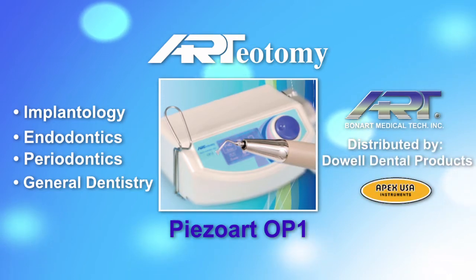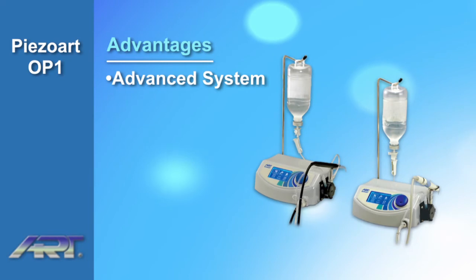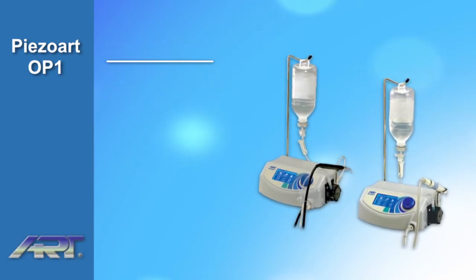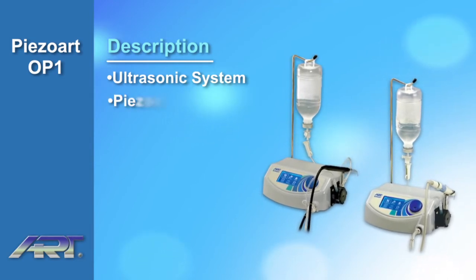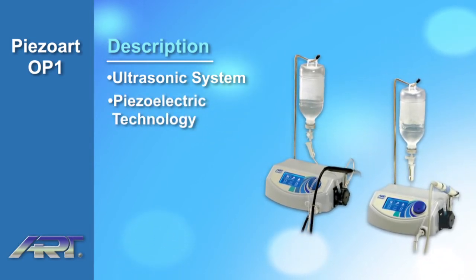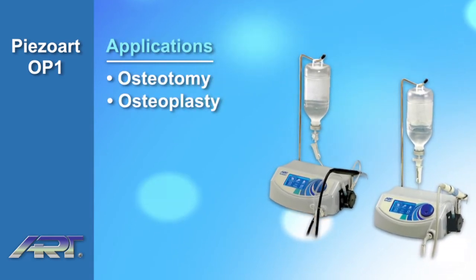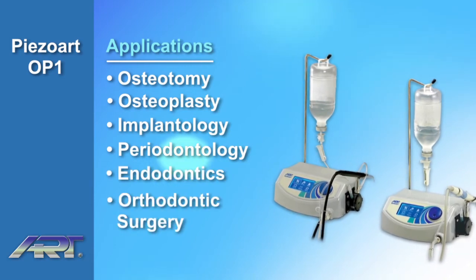Doing business as Apex USA Instruments in the United States, the Ardiotomy Piezoart OP1 offers the most advanced ultrasonic bone cutting system at an affordable price. It is an ultrasonic bone cutting system driven by piezoelectric technology, designed for osteotomy and osteoplasty used in implantology, periodontology, endodontics, and orthodontic surgery.